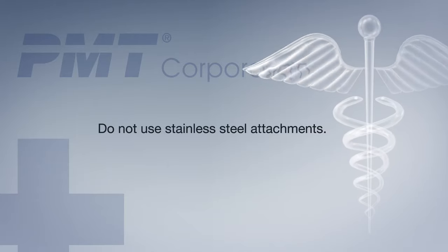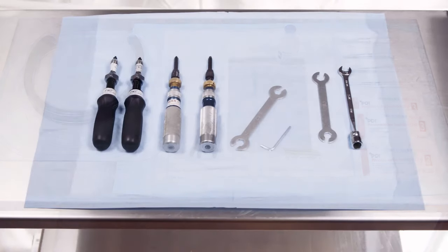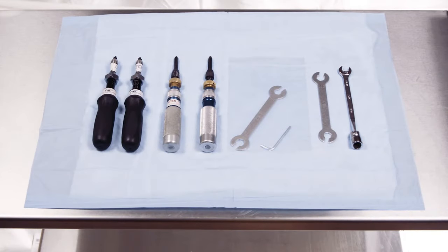Stainless steel pins or attachments should not be used with the PMT HALO. For optimal HALO application, ample room and assistance are crucial. Our standard prep table is shown here. Please see the instruction manual for a detailed list of instruments.